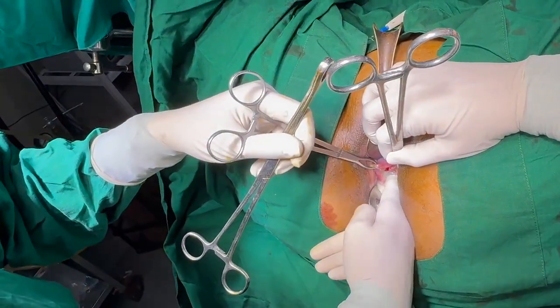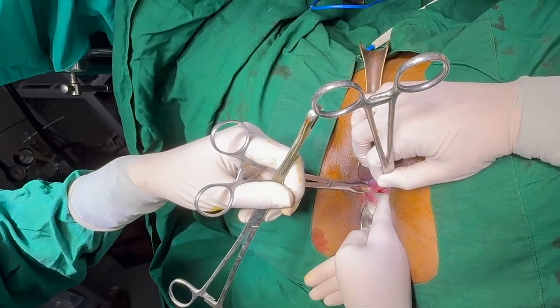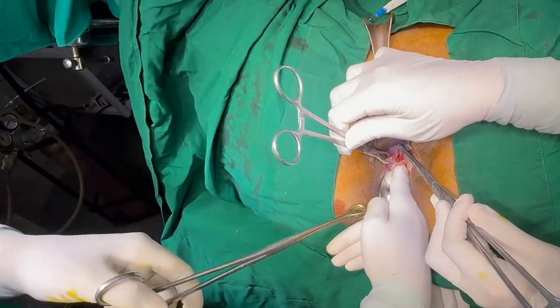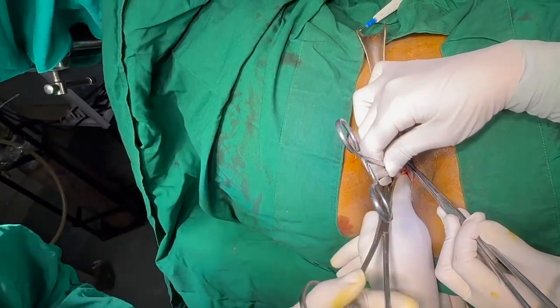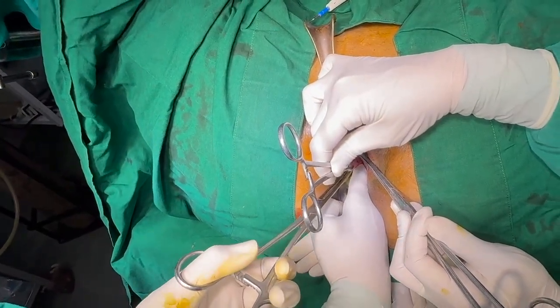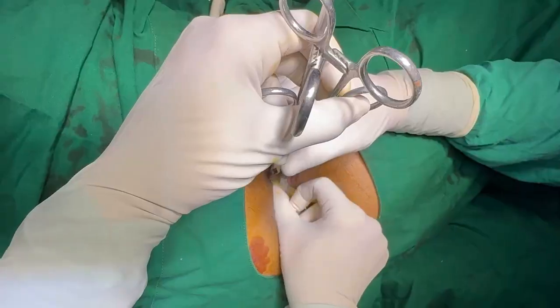As in this case, membranes were protruding, but they were not prolapsed. The patient was not in active labor, so we decided to go for cervical encerclage. Cervical dilatation was less than 3 cm.